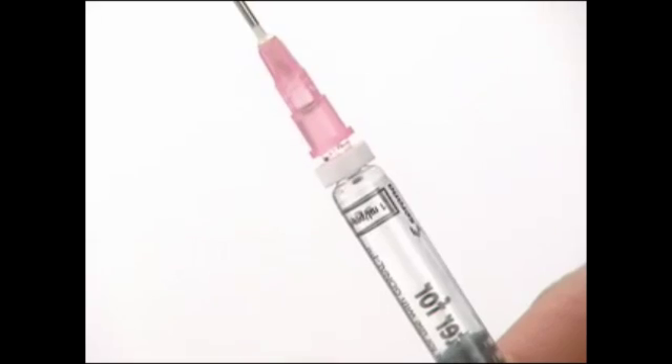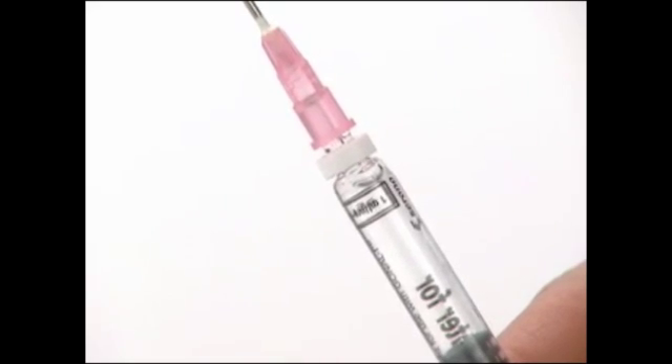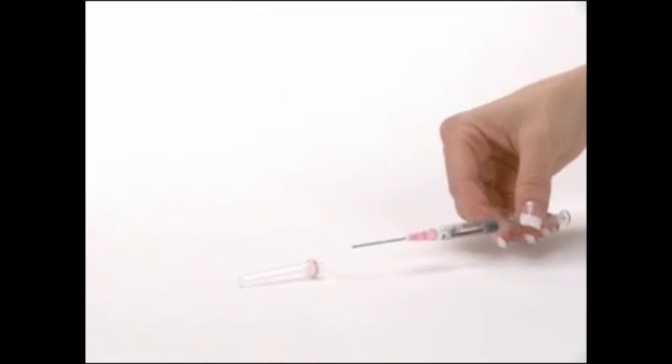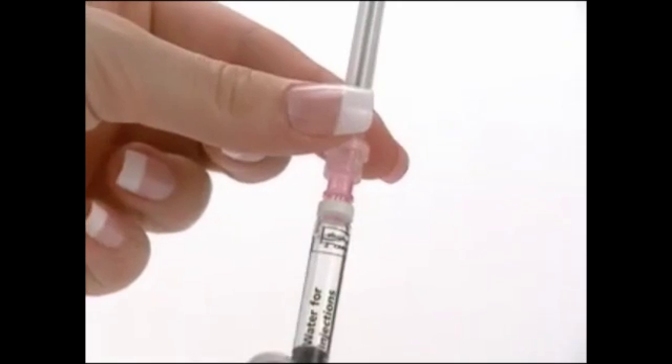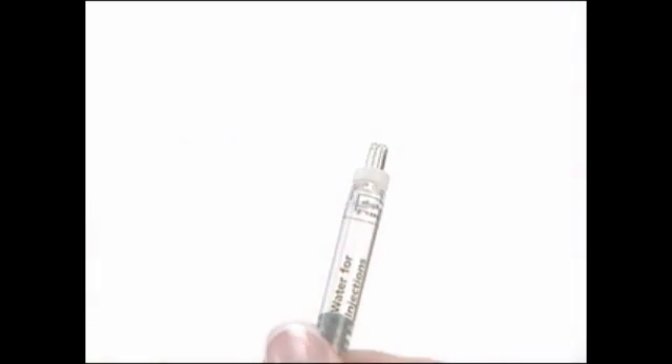Gently pull the plunger back to allow a small airspace. Carefully recap the needle. Twist and pull off the mixing needle from the syringe and discard in your safety container.